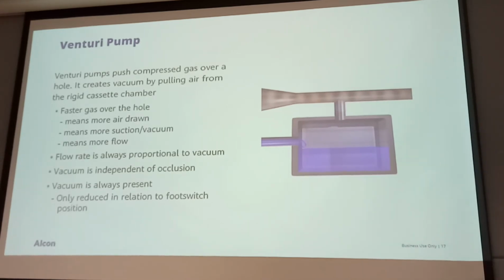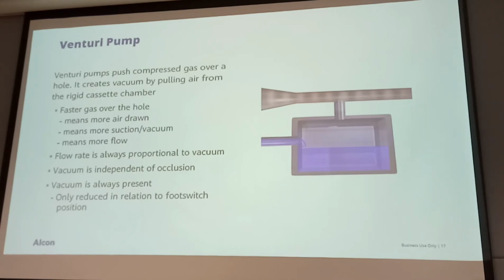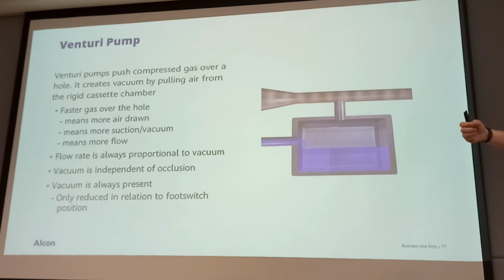So the flow is dynamic. When the flow is dynamic, as we understand, flow is controlled for what? The nucleus coming speed, right? The vacuum setup speed. If the flow is dynamic, you will see the nucleus come dynamic, the vacuum setup dynamic. So this is a different feeling when you use a peristaltic pump and a Venturi pump. So the parameter setting will be different. Okay.